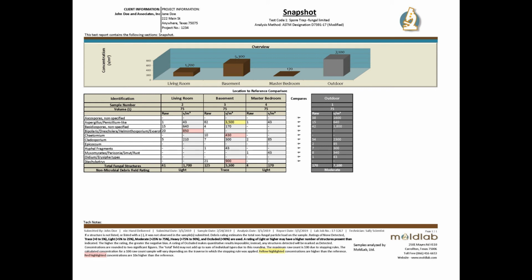In cases such as these, experience is extremely valuable in being able to interpret the effects of the weather on your outdoor air sample. If you don't yet have enough experience to make these sorts of determinations, this can be a very good reason to call us and use some of your consultation. Bear in mind that small fluctuations in mold concentrations are expected throughout a house. A difference of a few hundred concentration between locations is usually not cause for concern in and of itself.